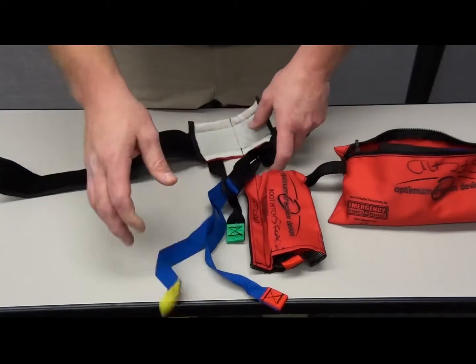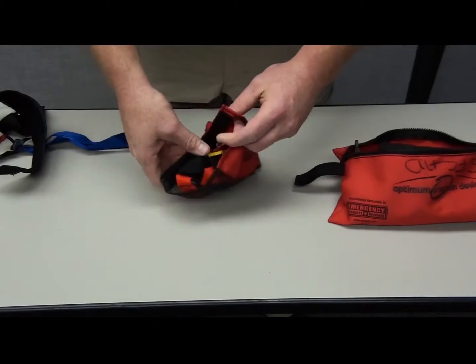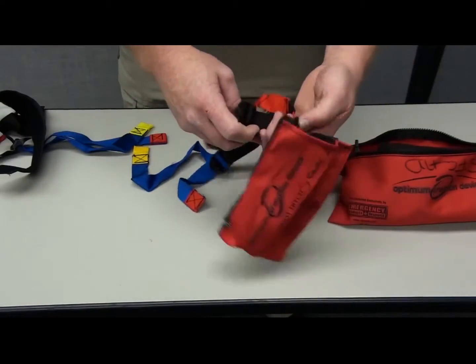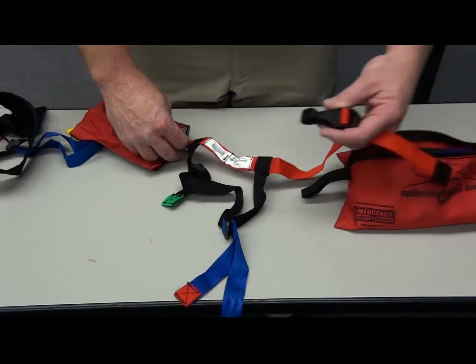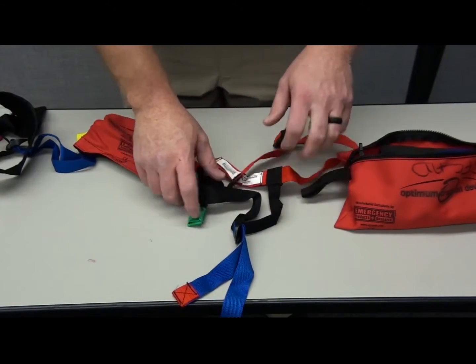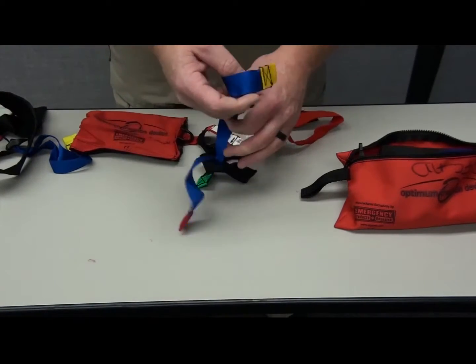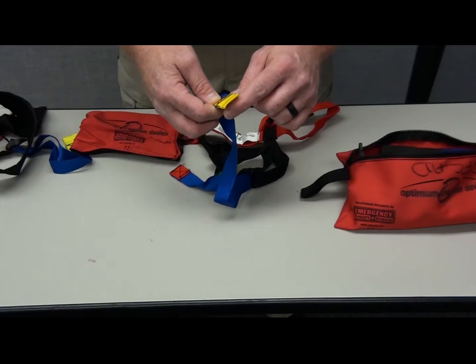This is where we put our peg and simply Velcro. So, the boot hitch. This all stays together. This just allows you to go around a bigger shoe or foot, or if the boot's still on and you can't get it off. We simply just come over, you click the items, and the same rules apply with the green tightens. This goes around, this goes to the back of the boot itself, and this will be the part that we place the traction peg into.